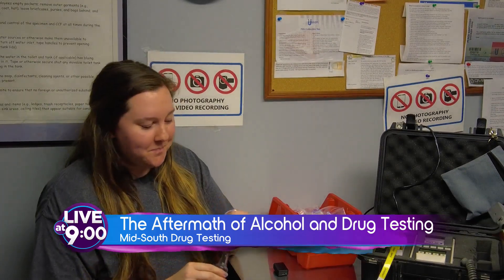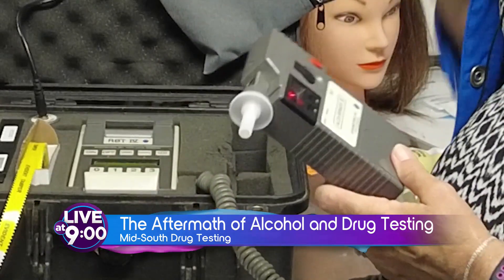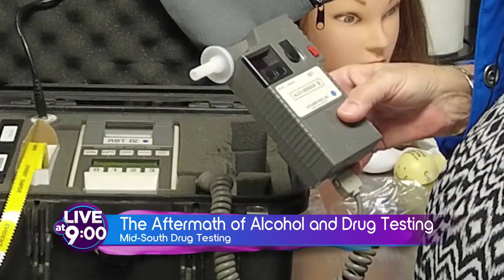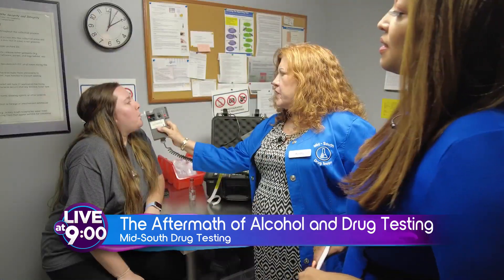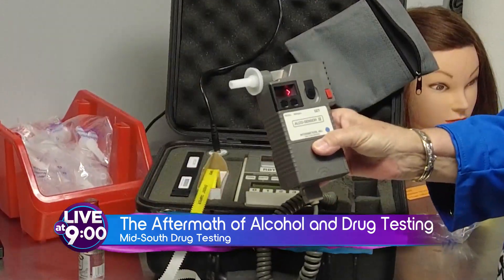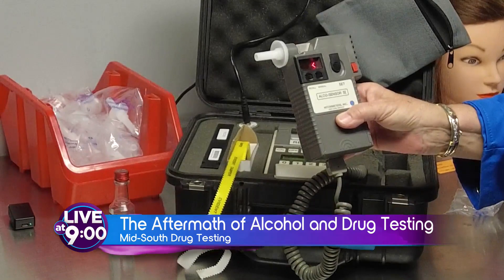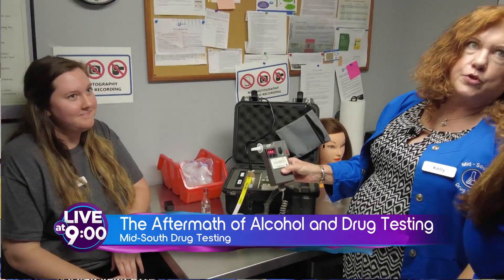Are we ready? Yeah. There you go. That's not really good — the way this works is that because she just put it in her mouth, it will make the device go into a positive, but it'll be gone in 15 minutes. Keep blowing. There you go. Now that's thinking — that's the little squiggle line going back and forth. You see it's taking a little while to read it. As a collector, that's our cue that they've probably had something to drink.